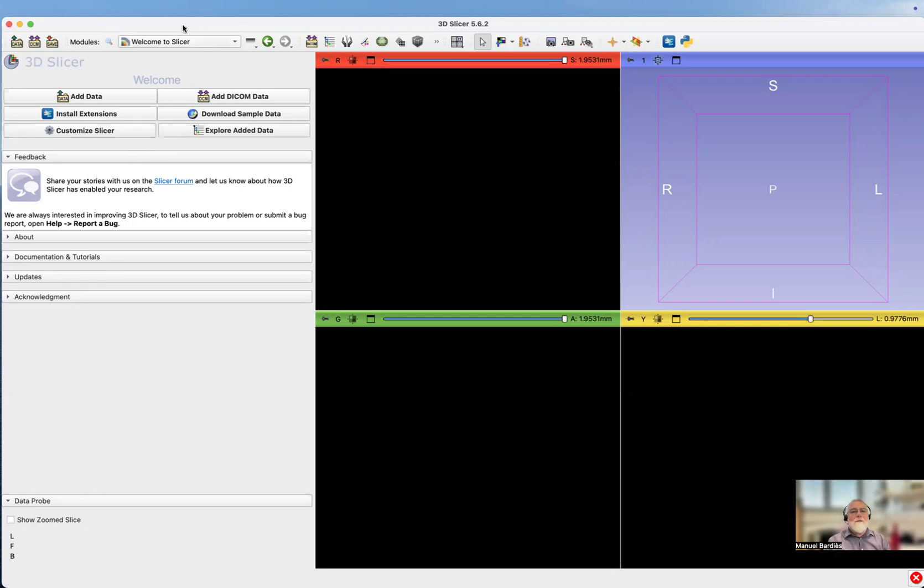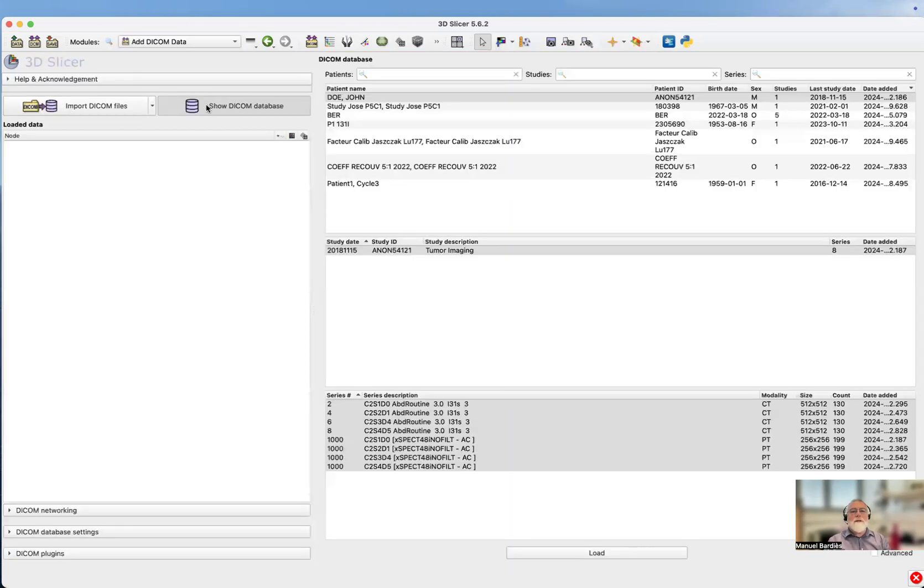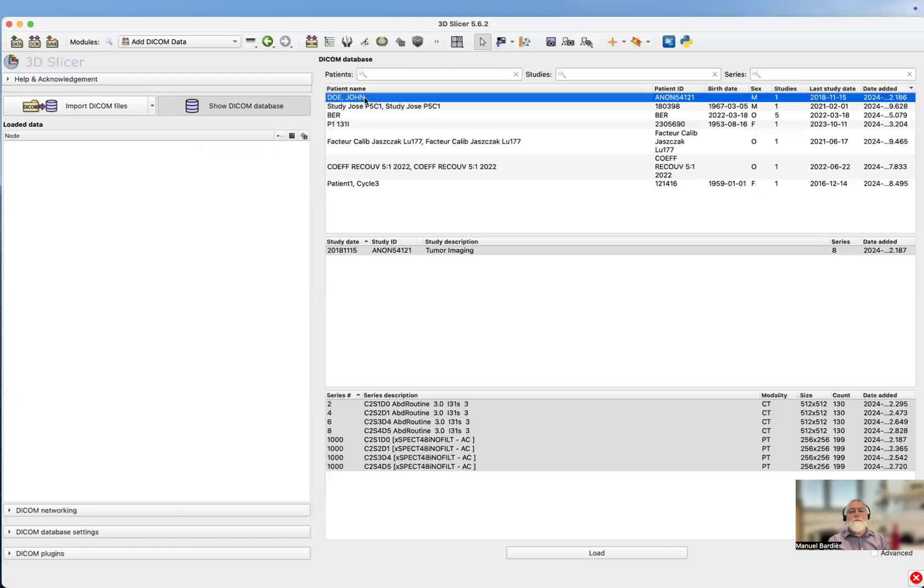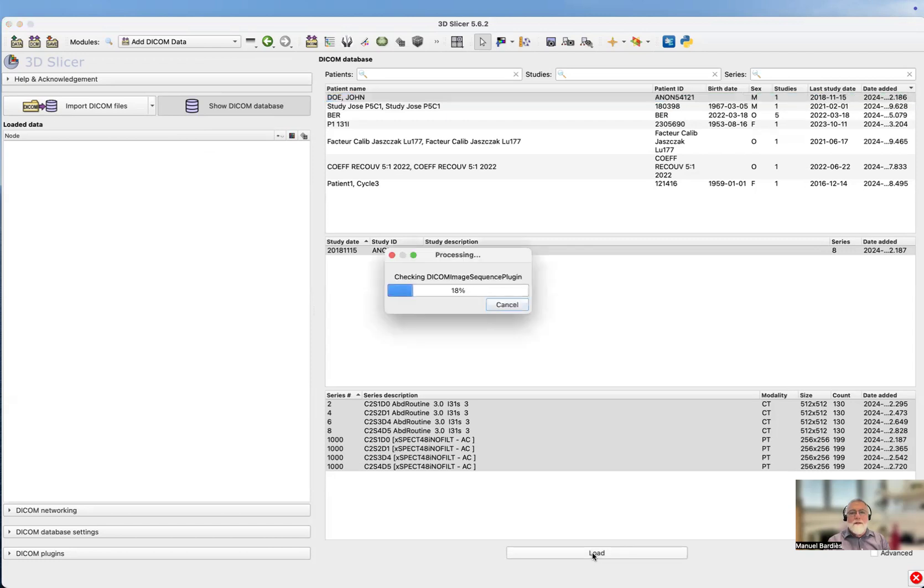The first thing we need to do is add DICOM data to select. It's already in the DICOM database, so we need to select that patient, John Doe, and then load it. That is going to be very quick.